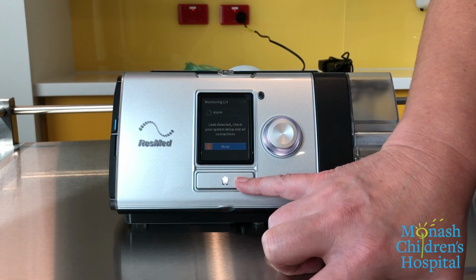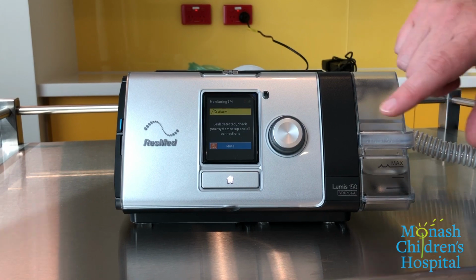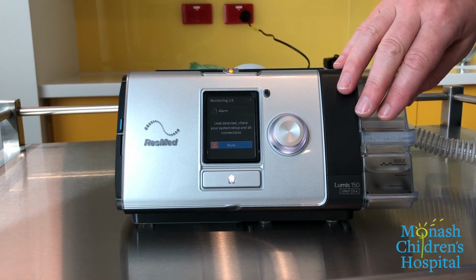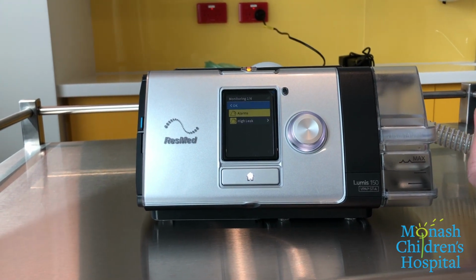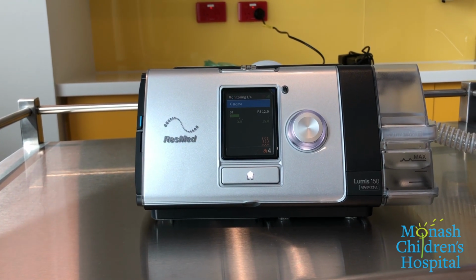Most non-invasive ventilators have alarms. Some of these are inbuilt to the device and some can be set by the prescriber. If there is an active alarm, an audible tone and flashing light on top of the machine will appear. What caused the alarm to trigger will appear on the screen. The alarm can be temporarily muted while you address the issue, otherwise the alarm will disappear as soon as the problem is fixed.